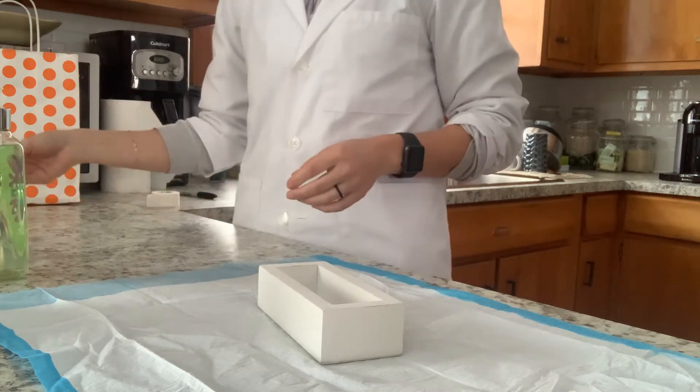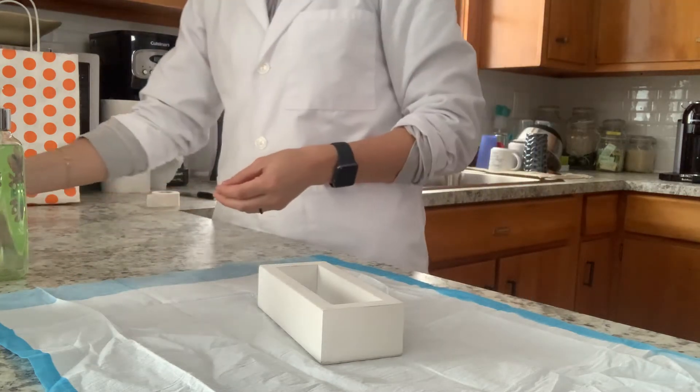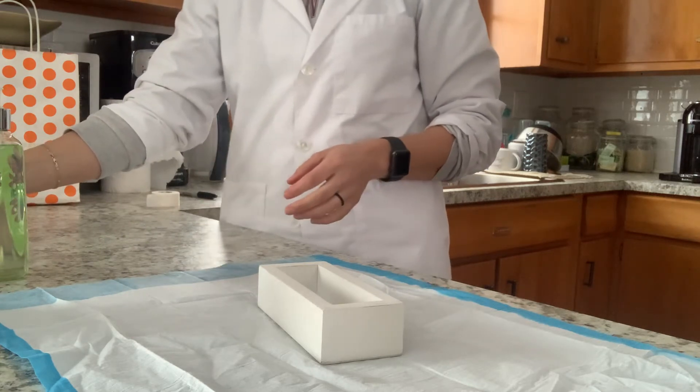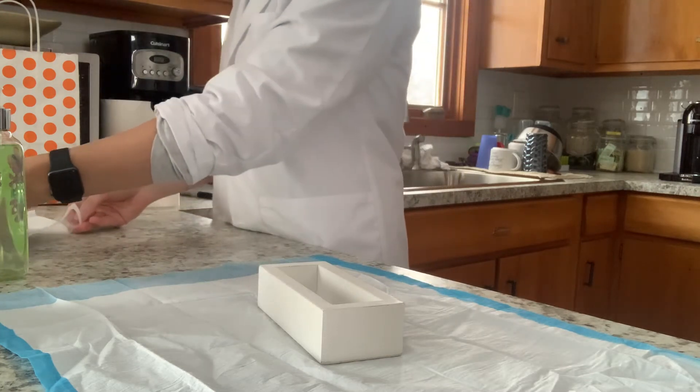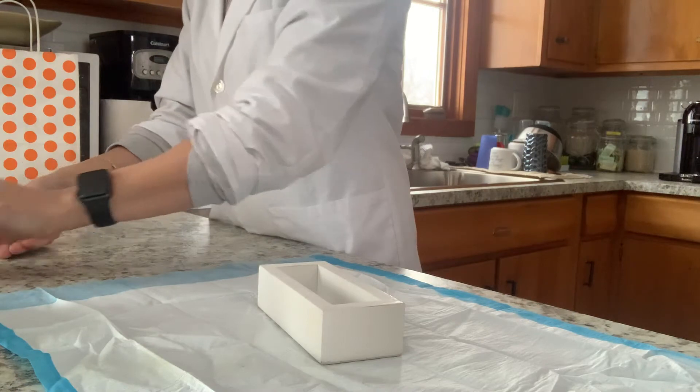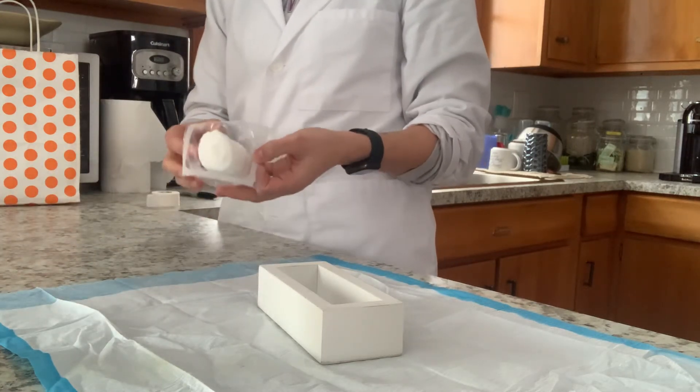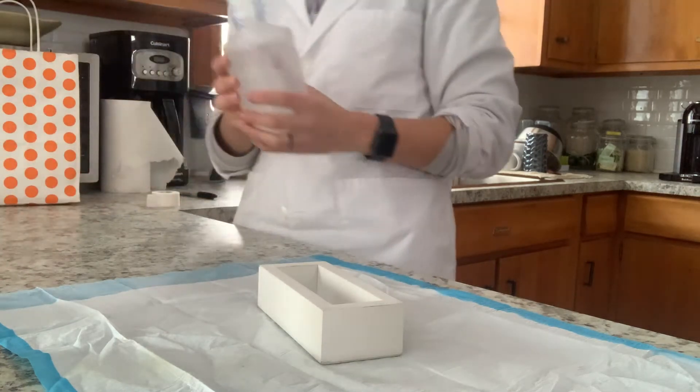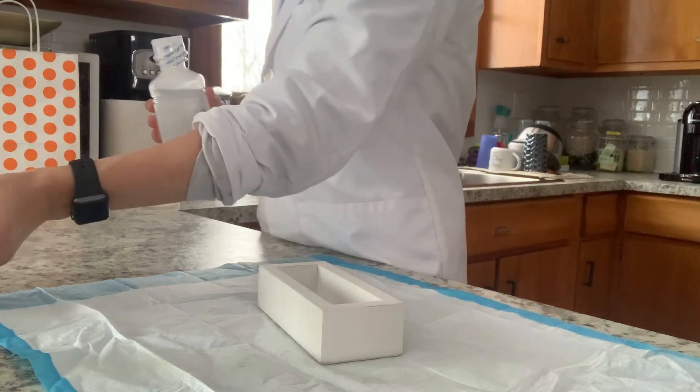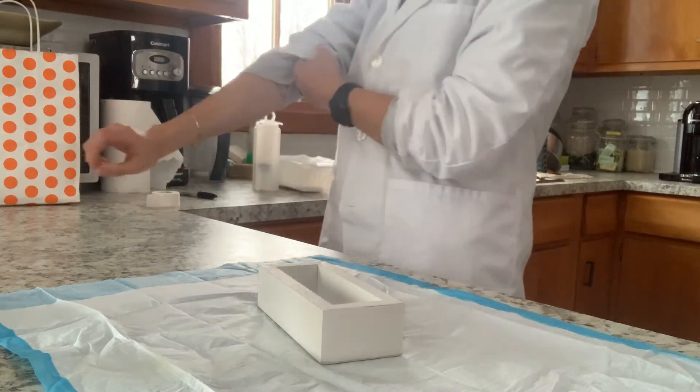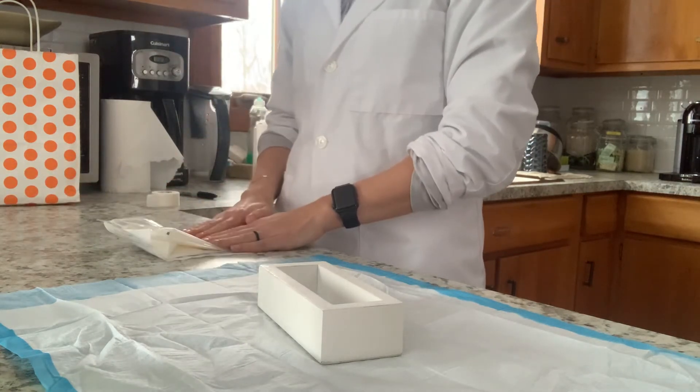So just so you can see what I have, I have my suture removal tray. All of these things have been previously opened. So I'm going to try to make it so that they stay. I apologize if you can hear my son in the background. He's not happy. I would have my ABD bandage that would not fall out of the package because it would be brand new and it would be fine. I have my four by fours and I'm just moving these up here for now, because again, I'm in an awkward situation. And I have my gauze roll. So the thing that I would do is I would, once again, take my sterile saline. I would pour some into my gauze roll and then I'm done with the saline and then I will hand hygiene again, not reaching over my patient because my patient would be in their bed. And then I'm going to move on to putting on my sterile gloves.